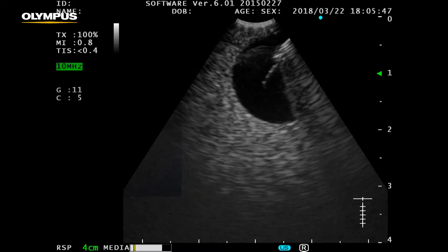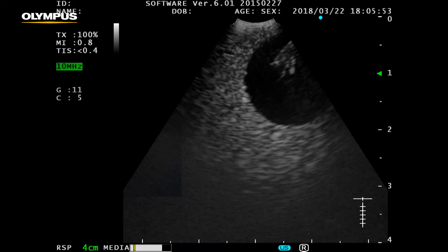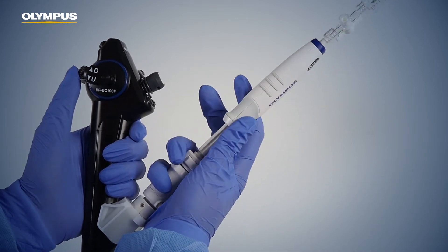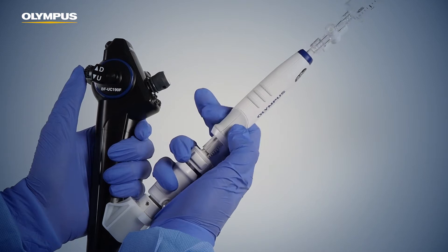By pushing the needle forward with the next movement, it can be seen that the needle is now steered distally, targeting a more peripheral area of the lesion. Using the angulation lever while the needle is inside the lesion thus allows the operator to fan through the lesion, which will result in the aspiration of material from different areas inside the targeted lesion.